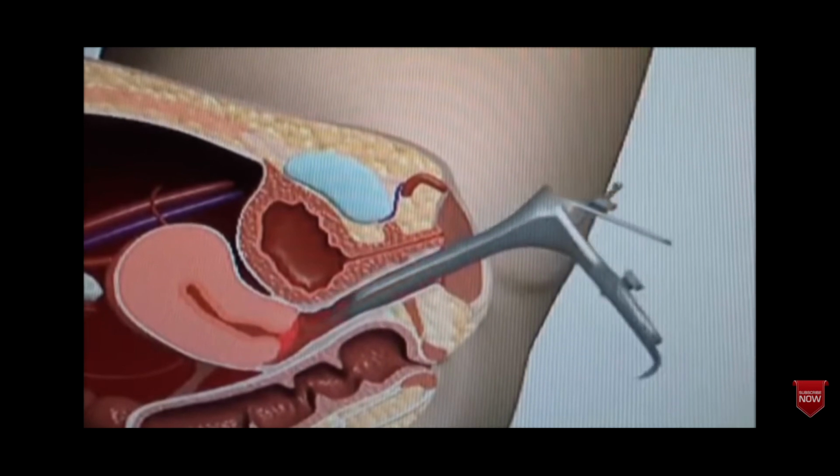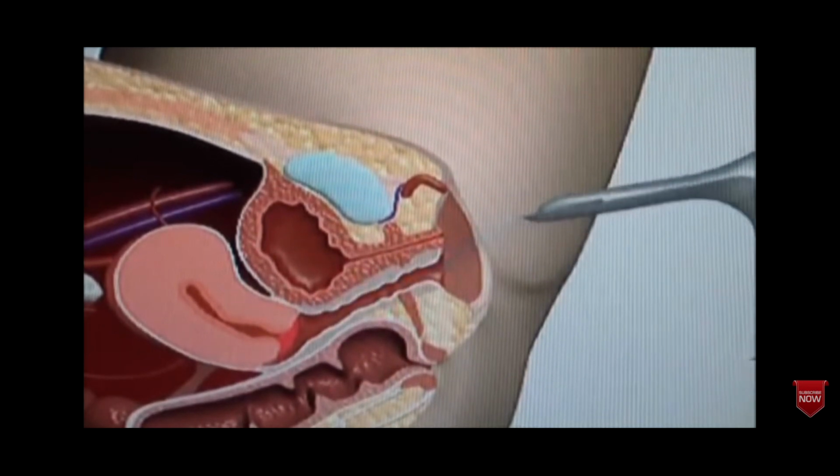So this is how it's done, class. So you insert the speculum.